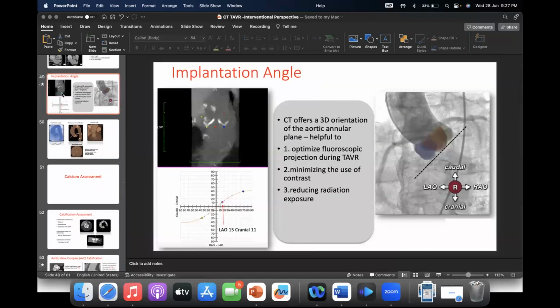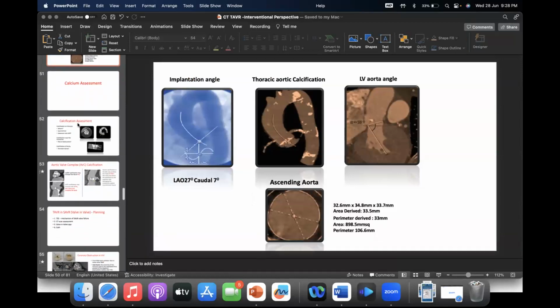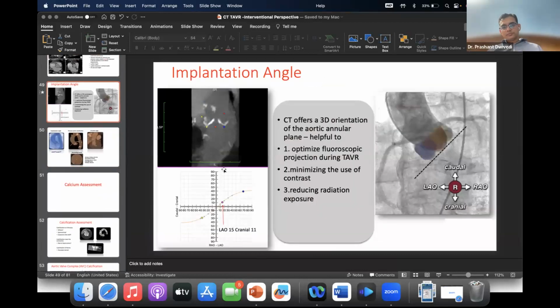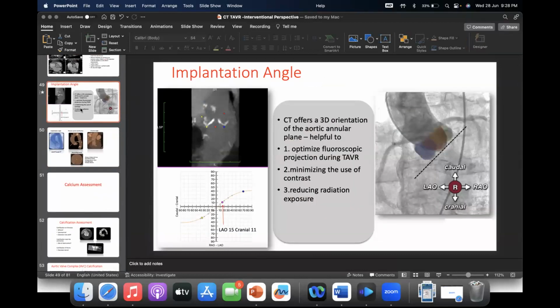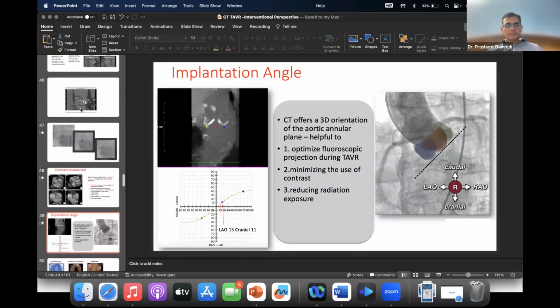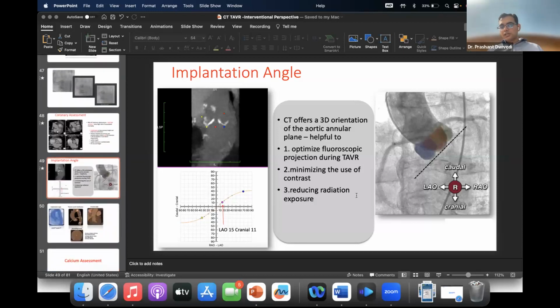the fluoroscopic angles. I think the horizontal aortic angle can be very well assessed with CT in a coronal plane. It fails to answer only one question, that is the radiographic angles, the fluoroscopic angles. Other than that, I think everything else can be done on a normal routine CT with MPR capability and curved reformat imaging. Yes, perfectly the same. CT can answer almost all the questions.